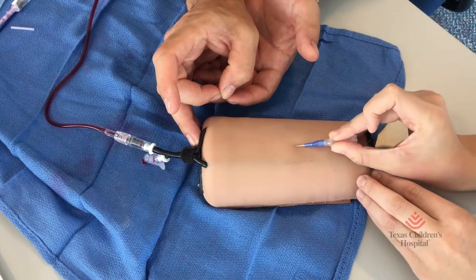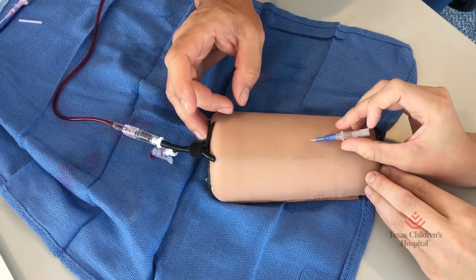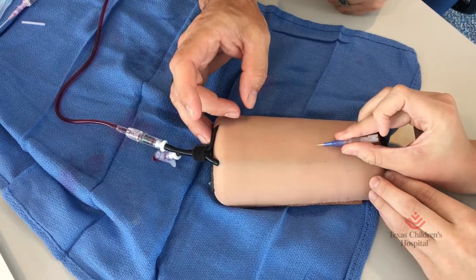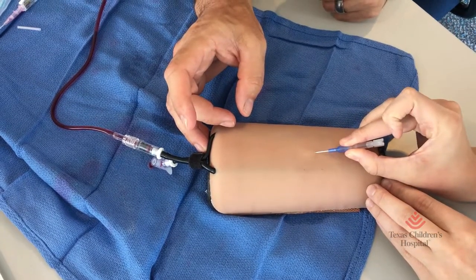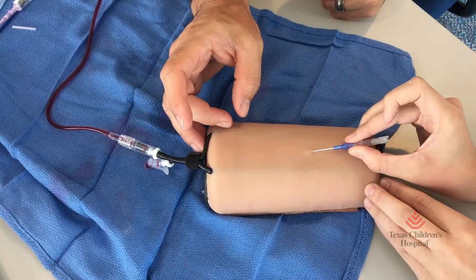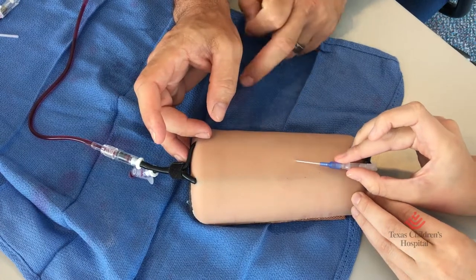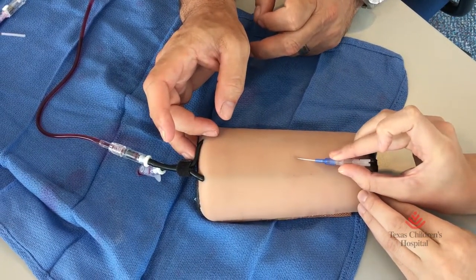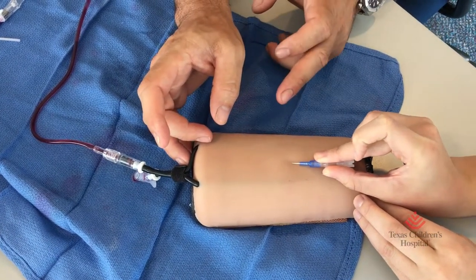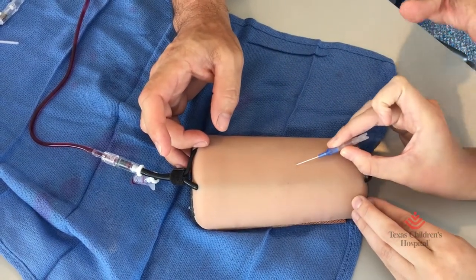On the pull back, I want you to pull it back just enough but don't come out of the patient's skin. Come back — because this is going to get — almost all the way, keep coming out a little bit but don't come out. Now you're going to redirect. There you go. And now advance again. Take this catheter out. Then you would come back straight out and then redirect again, then in.